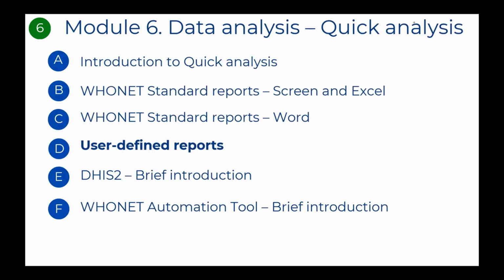In Section B and C, we reviewed reports that were prepared by the WHONET team for your use. They are simple and convenient. However, you cannot change them. Now in Section D, we will look at the creation of user-defined reports. You can create daily, weekly, monthly, quarterly, and yearly reports, and you can customize these for the pharmacy, the infection control team, national authorities, and other collaborators.